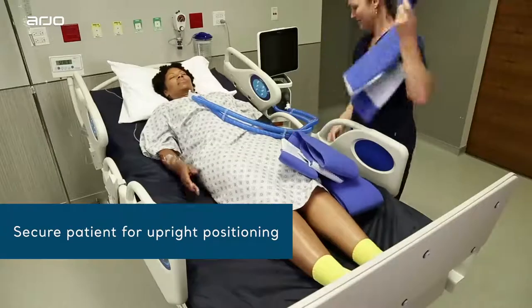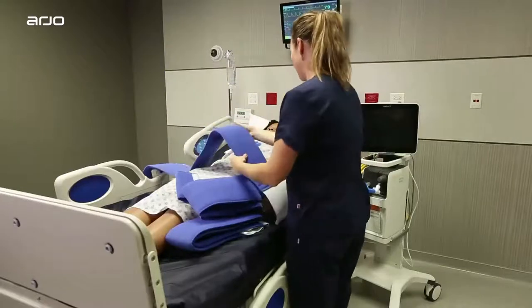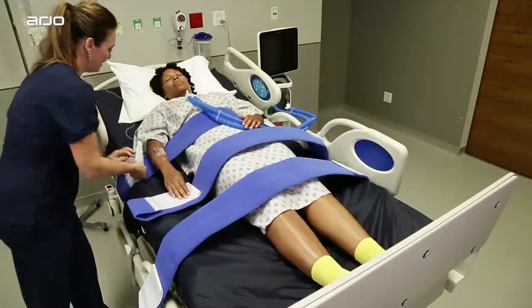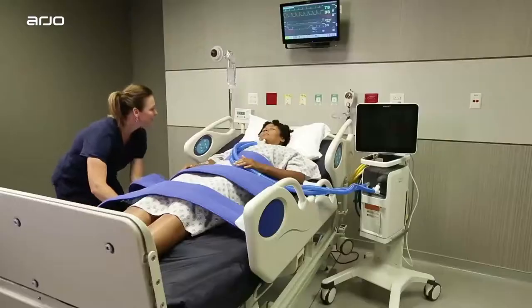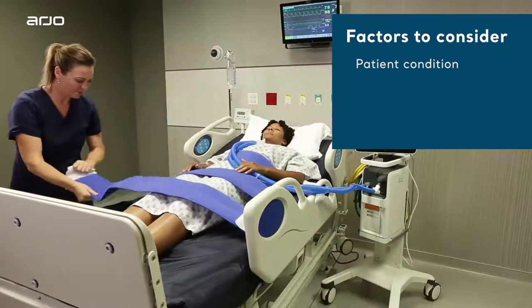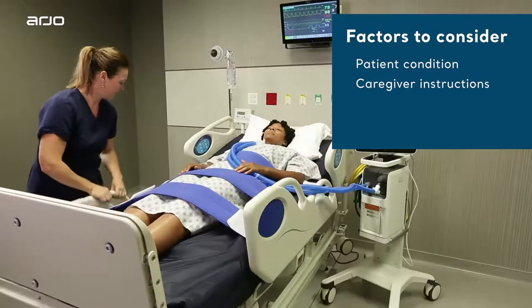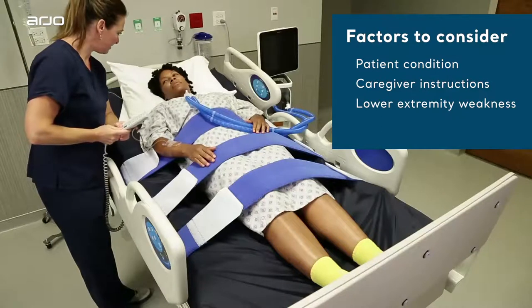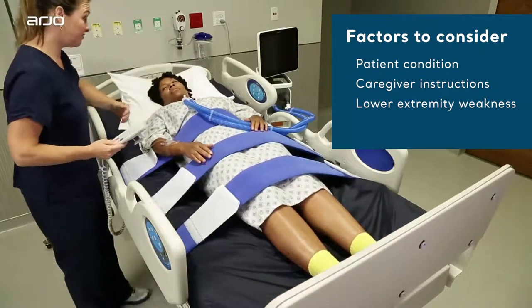It's vital to secure the patient before tilting the bed to an upright position. The Total Lift Bed features a very strong and stable strapping system. Ideally, the straps should be placed securely across three areas: chest, hips, and either at or slightly below the knees. Please note that these are general recommendations. The strapping system is modular and should be used according to the patient's condition as well as any specific instructions given by an authorized clinician.